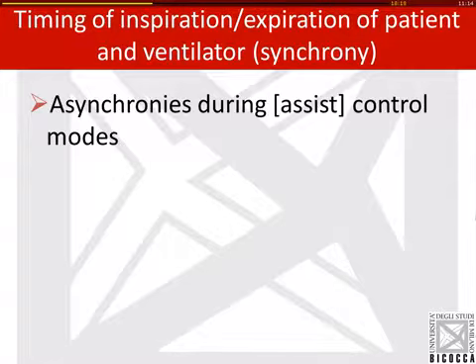At our institution, we don't use assist control modes much, but I know it's very frequent, and I think it's perfectly fine to use assist control modes as long as we are aware of the potential risks. So when we have a patient on volume assist control or pressure assist control who is not sedated and paralyzed, he or she can breathe, and there might be risks of asynchronies.